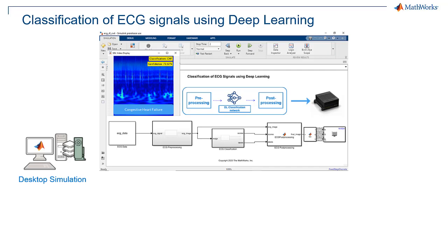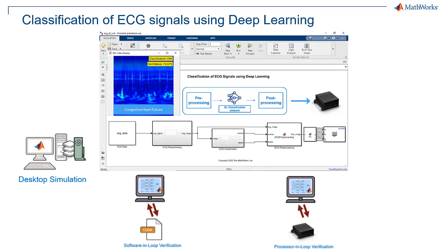Then, we'll verify the generated code by running software-in-the-loop testing on desktop GPU. We'll go one step further to verify the generated target code by performing processor-in-the-loop testing on the Jetson board.